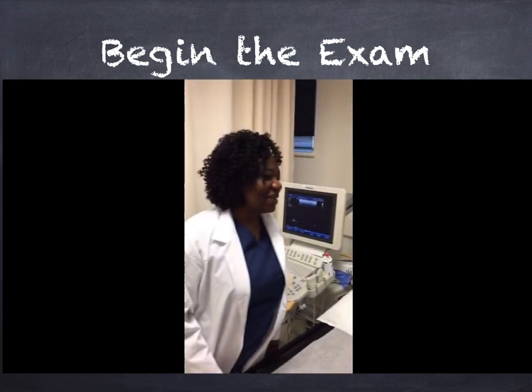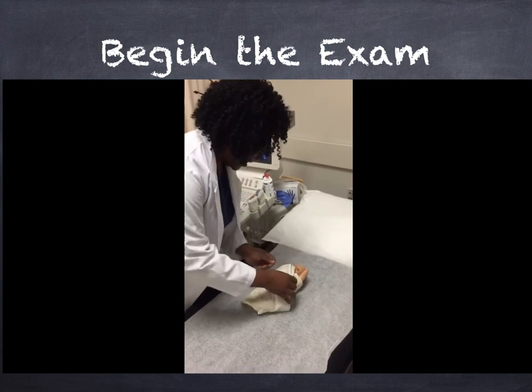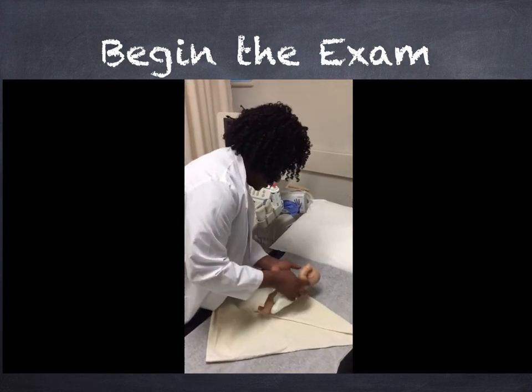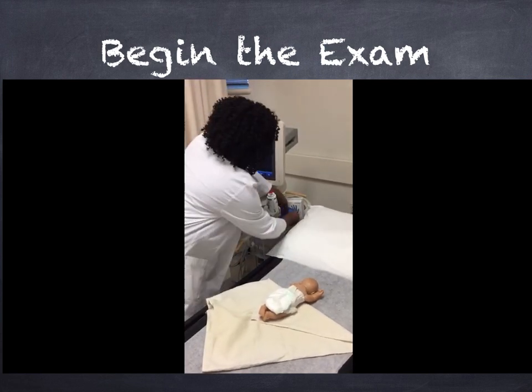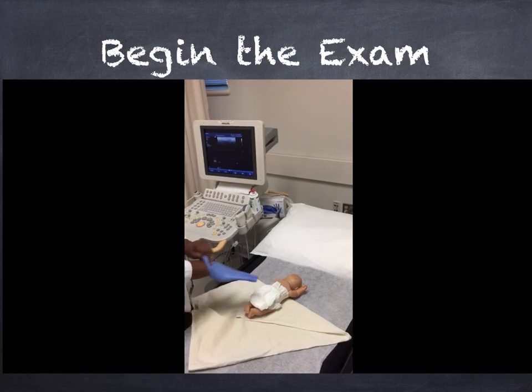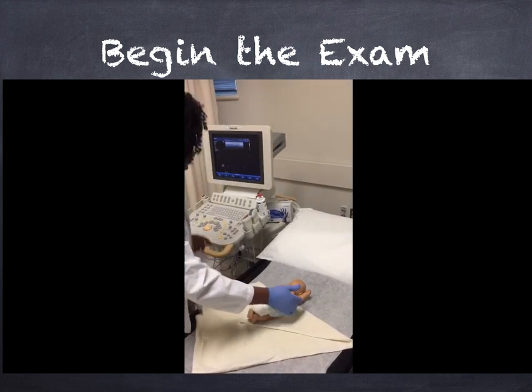When you begin this exam, make sure to explain the ultrasound to the parent and ask verbal permission to perform the exam on the infant. Unbundle the baby and gently place them face down with a pillow underneath the hips. The pillow will help stabilize the baby and give you better images. Lower the diaper and don't hesitate to ask parents for help in keeping the baby calm — this could mean being fed beforehand or having a pacifier.